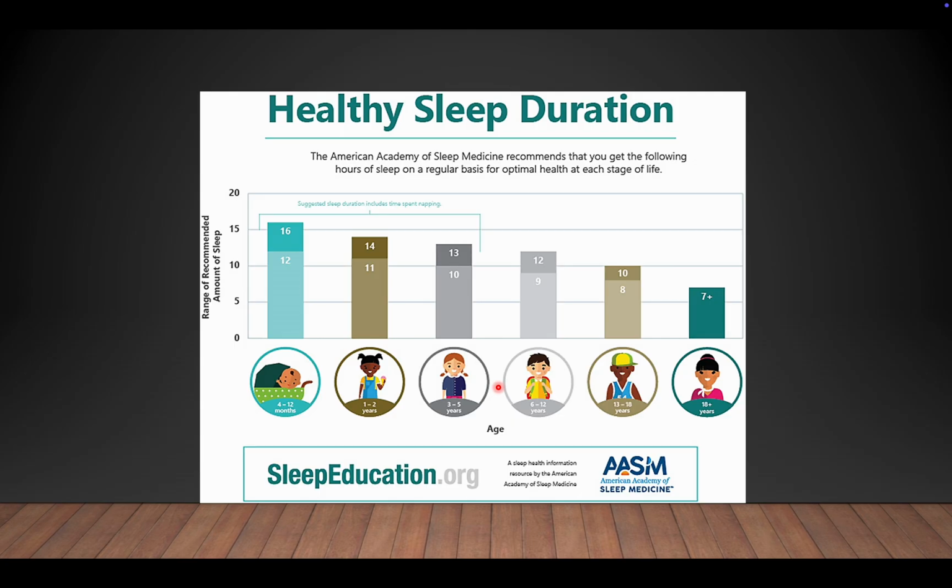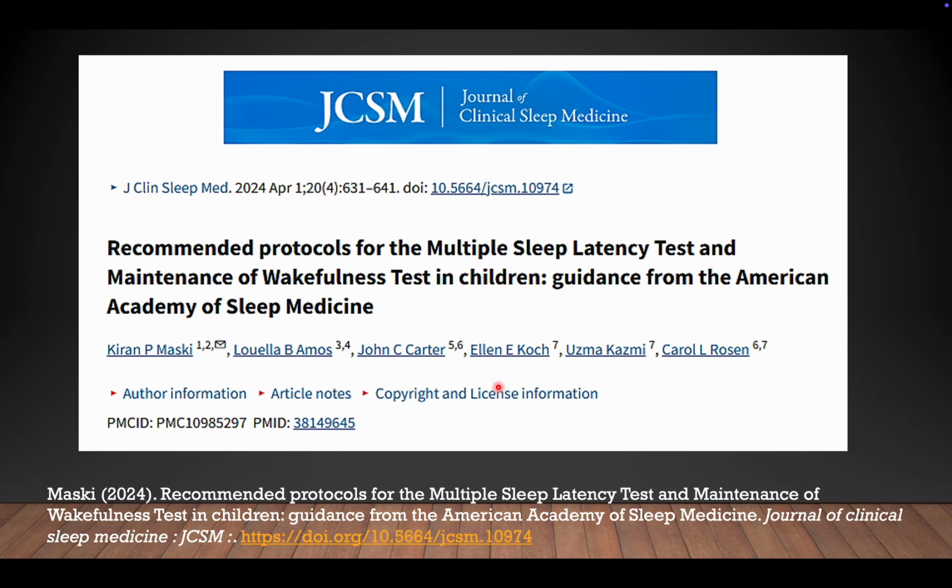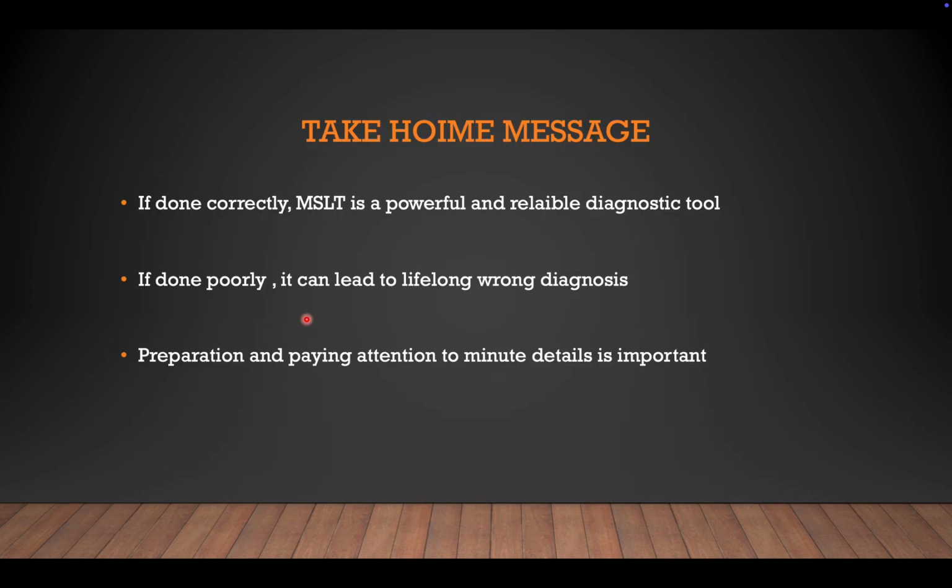And more emphasis needs to be given to preparation, as in the case of medication washout, especially for stimulants for ADHD, which are common in pediatric populations. These are some of the things additional to the adult. Again, we can read this recommended protocol from Maski et al.